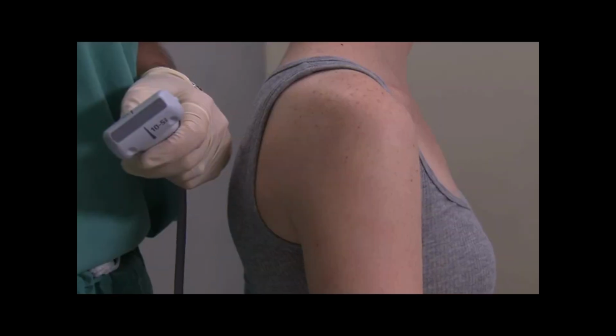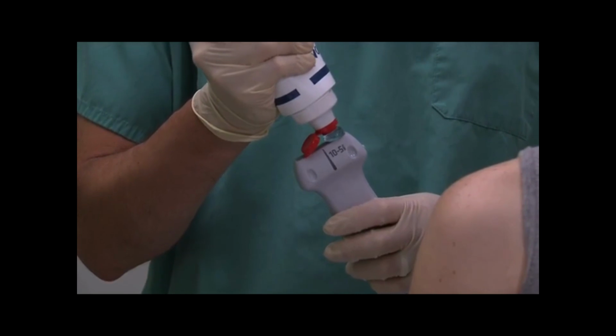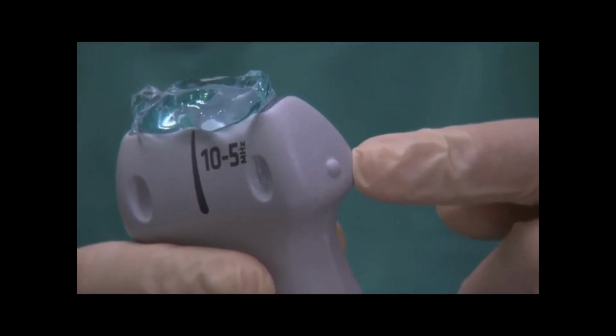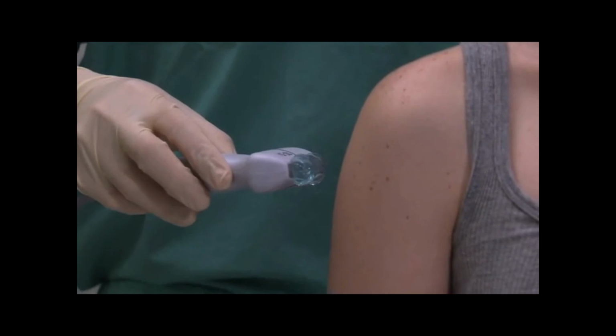Begin by positioning the patient with their back towards you so that you are in a comfortable position to both perform the ultrasound and see the screen. Cover the transducer with plenty of coupling gel. Note the orientation of the probe indicator. It's always going to be to your anatomic left side as you approach the patient posteriorly.